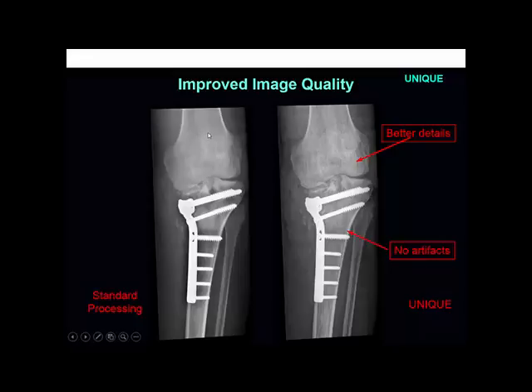And what we see in this knee is that first of all the details that are visible are quite okay in the conventional image processing, but here this black area around the implant is the dangerous area of edge artifact. This relates to this brownish line of the image of the beach, and here you see a black frame around the implant, which could be a medical implication. This could mean that this implant is getting loose because of an infection, but in fact if you look at the right image, it's nothing else but an image processing artifact.